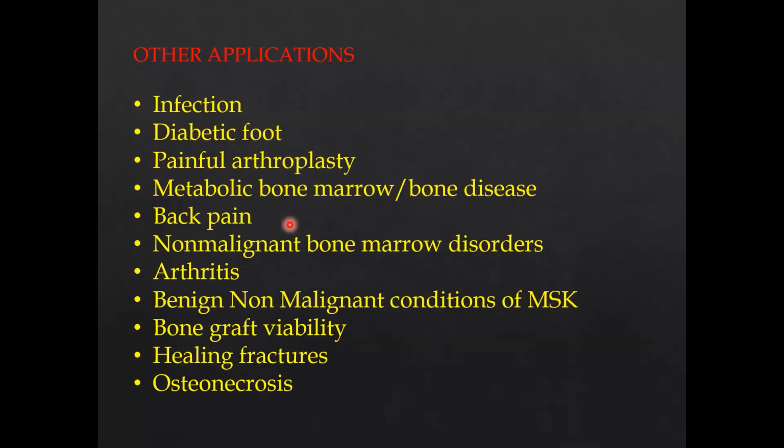We know so many things are happening, especially related with the joints, arthritis, or any infection, inflammation, or tumors. Coming to non-malignant bone marrow disorders, arthritis, benign non-malignant conditions of the musculoskeletal system, bone graft viability, healing fractures, and osteonecrosis.